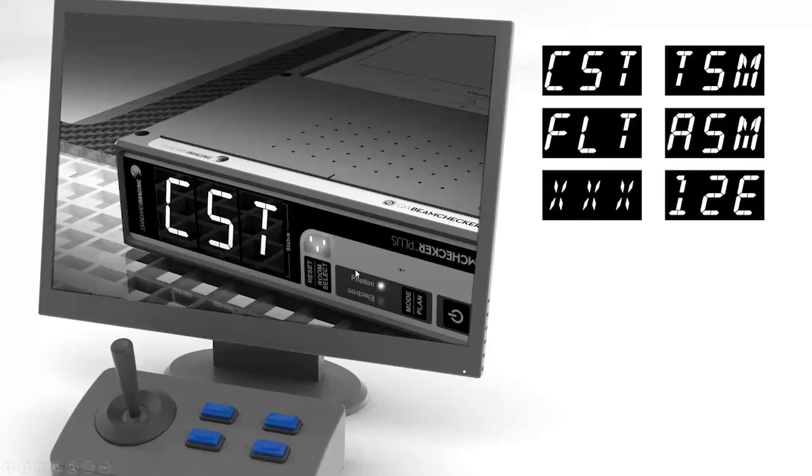In the case where you have an action level 1 error, the lights would flash red at you, and there would be a slow beep that would occur as well. And you would be required, whenever there is an error, for safety's sake, to walk into the bunker and press this reset button.